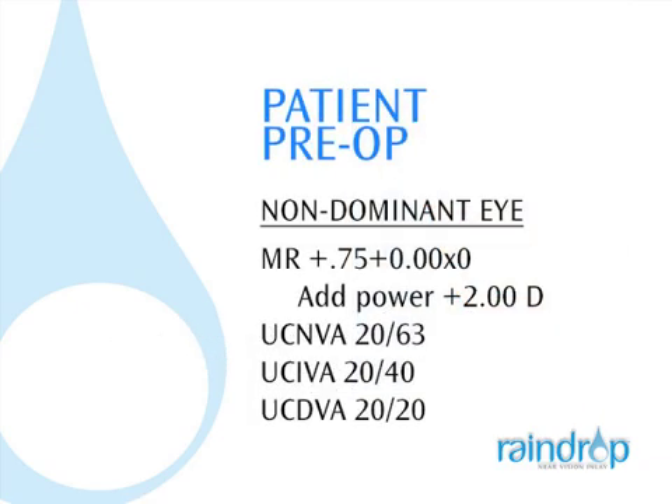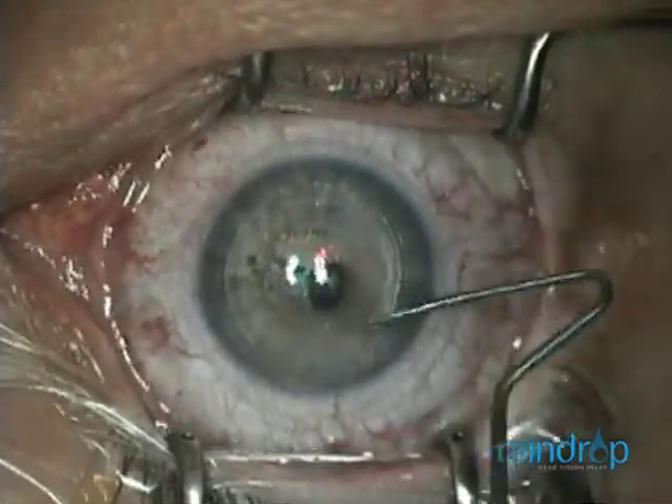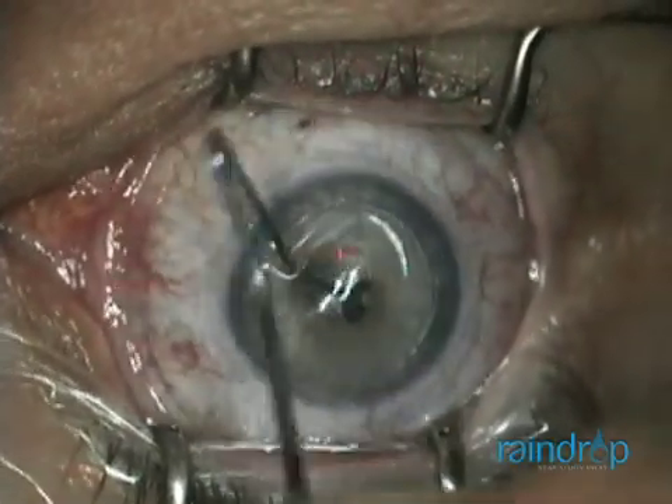This particular patient is emmetropic with an uncorrected near-visual acuity of 20 over 63. First, I perform an 8.5mm IntraLase femtosecond laser flap targeting 160 microns depth.